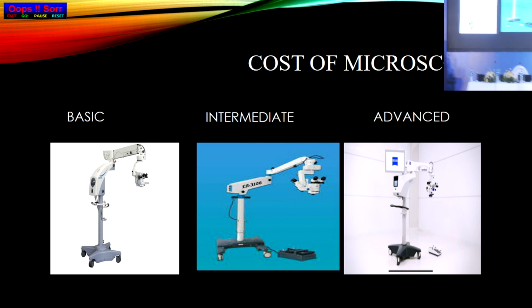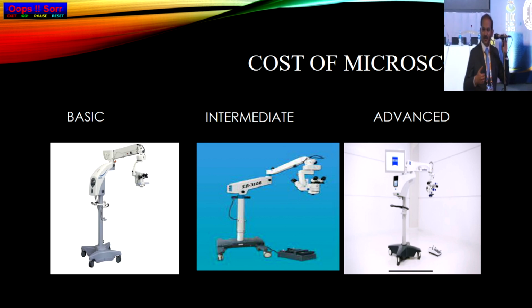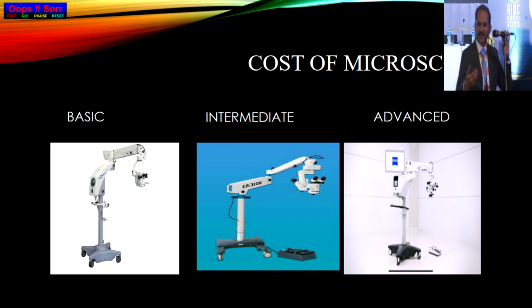See, basically, just remember one part. A person who's going to sell the machine will be selling for the reason of upgradation. Only 1 in 10 of the people will be upgrading to a higher end and selling. If I'm planning to sell it off, it says that there's a fault in it. So I'm not happy with it. I had a word from my father, who was an ophthalmologist.